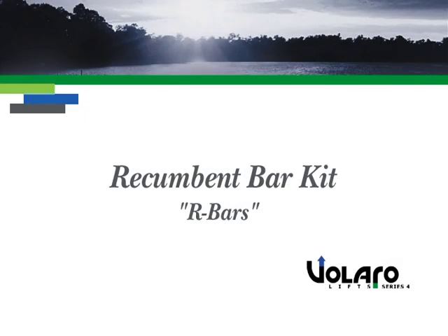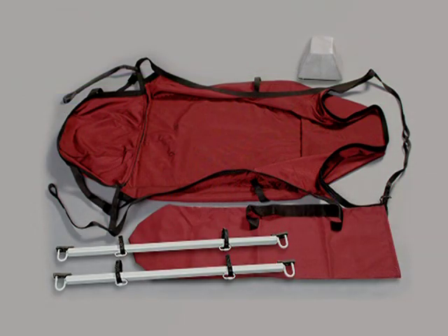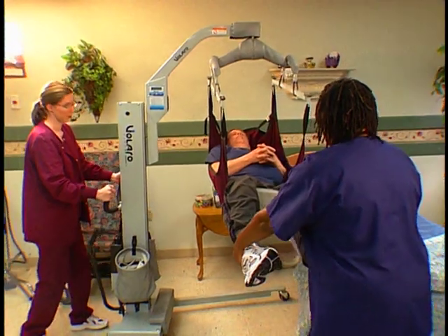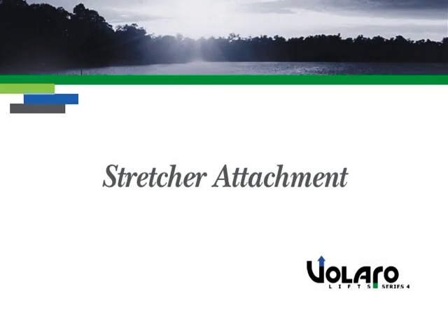Recumbent bar kit, R-bars. The recumbent bar or R-bar kit was developed by SMT Health Systems to help transport hip replacement patients or persons whose bodies are less flexible. If you'll be using the R-bar attachment, please be sure to consult with the patient's healthcare provider for proper patient positioning and transport.